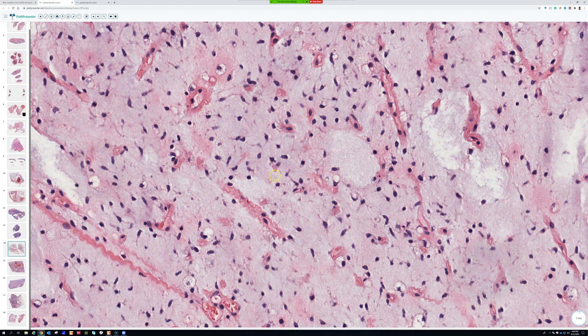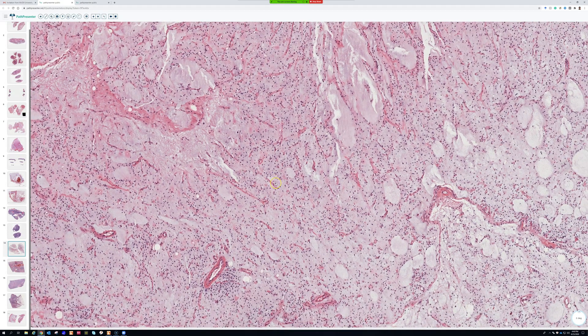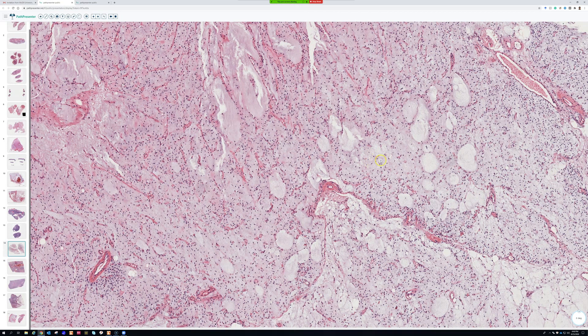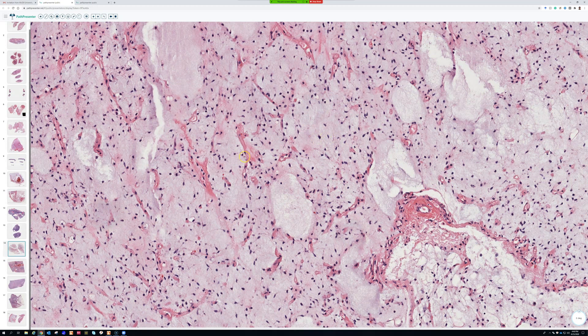By any rule, this tumor looks benign. The only way to recognize what this is, is by pattern — not cytological atypia, not mitotic activity, not the stuff we use to teach first-year residents how to identify cancer. It doesn't look like cancer; it looks like a benign something. I've seen people mistake this on needle biopsy and call it myxoma or something else.